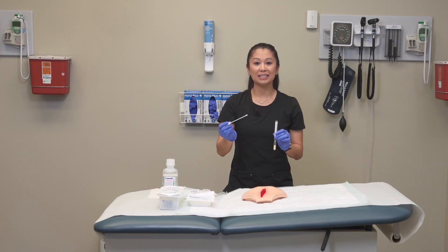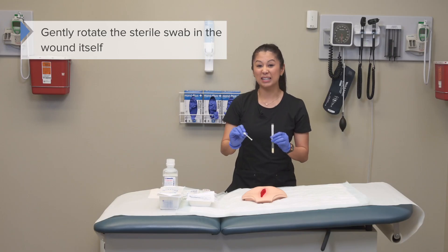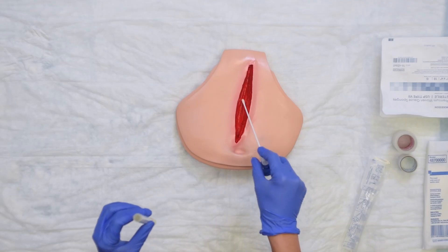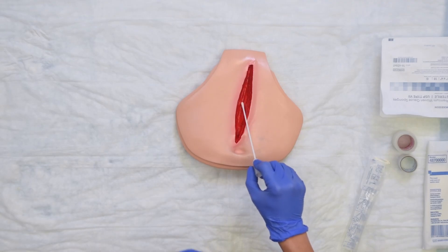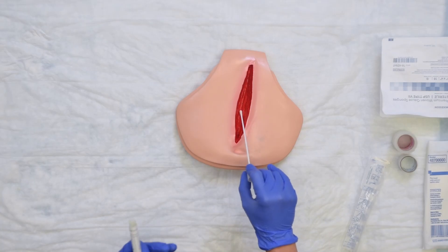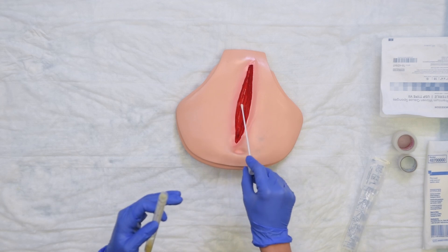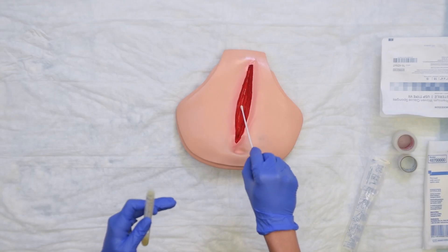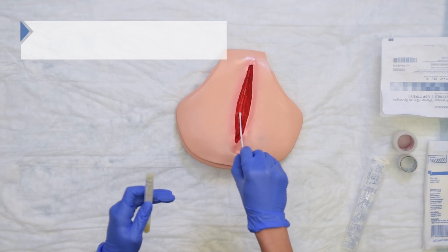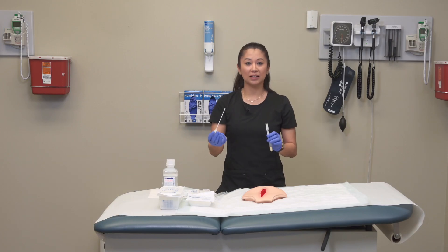Take the swab and gently rotate it in the wound itself, starting at the deepest part. Use a 10-point zigzag fashion depending on the size of the wound. Make sure you're actually depressing the tissue to express fluid and exudate and collect tissue from the wound — you want all of that material for the sample.